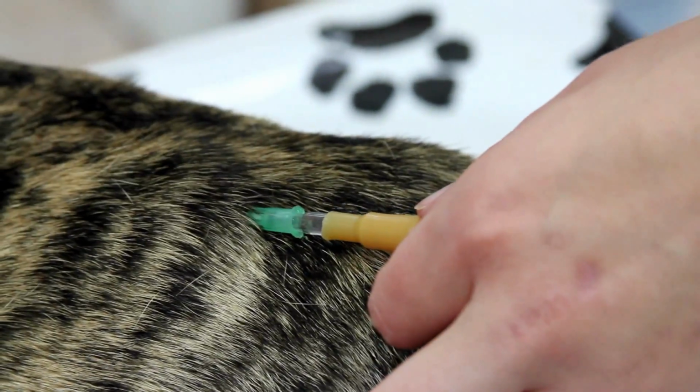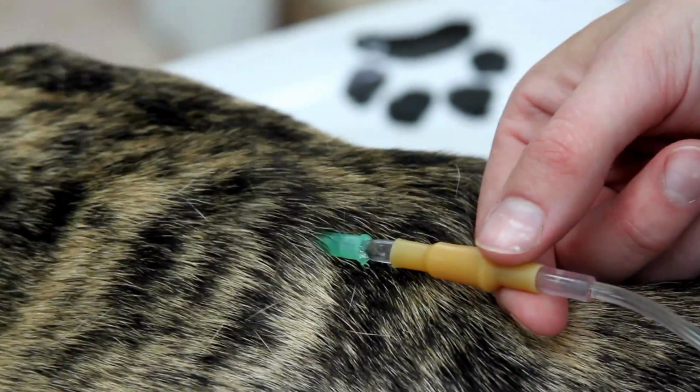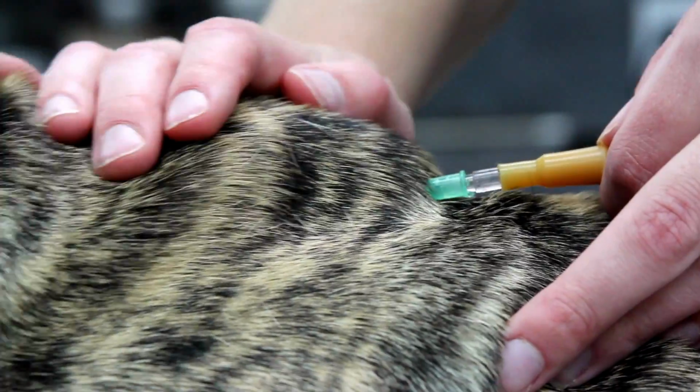Once we get to a certain amount, you're going to start to see a little bleb start to form. You may notice a little bit of fluids kind of dripping around the needle there, or even out of the hole that you've made. You can just take a little bit of Kleenex or some gauze and just kind of wipe those areas if you need to.